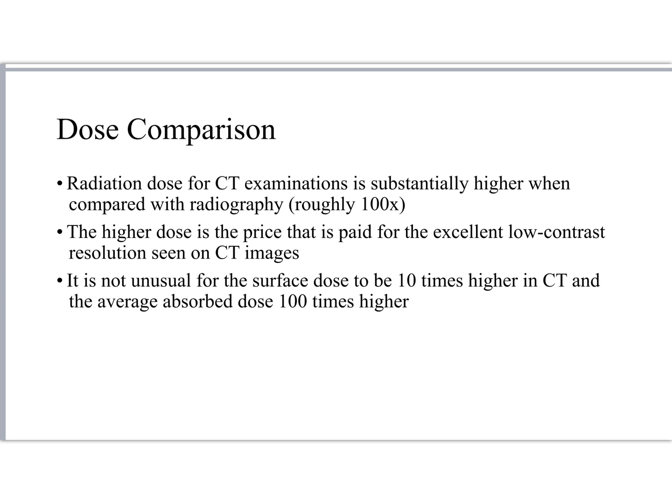Well, sometimes we compare this to things like natural background radiation, which can be helpful to the patient. But from our point of view as an X-ray tech or CT tech, we need to be thinking about actual factors. And at the end of the day, CT scans are about 100 times more radiation than your average diagnostic X-ray exam.